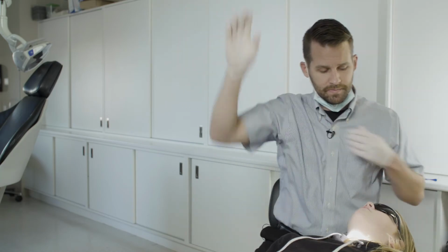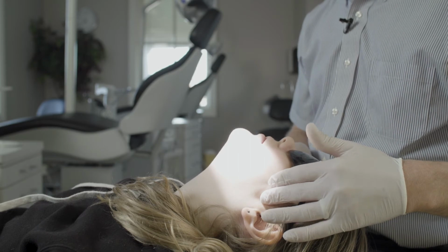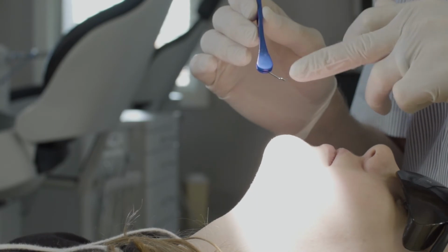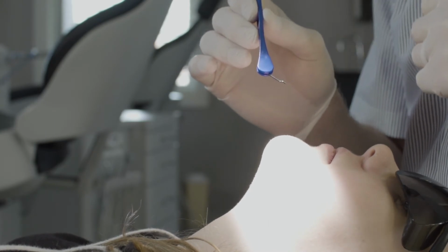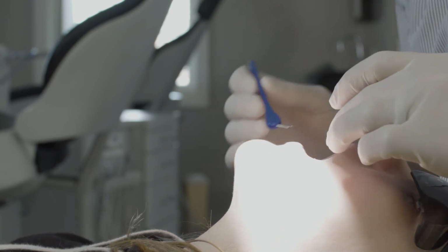Next, what you'd like to do is have your child tip their chin up towards the ceiling, almost as if they're trying to look behind them so that you can see the expander properly. Prepare your key by having the metal portion at a 45-degree angle to the plastic handle. I'll get you to open.